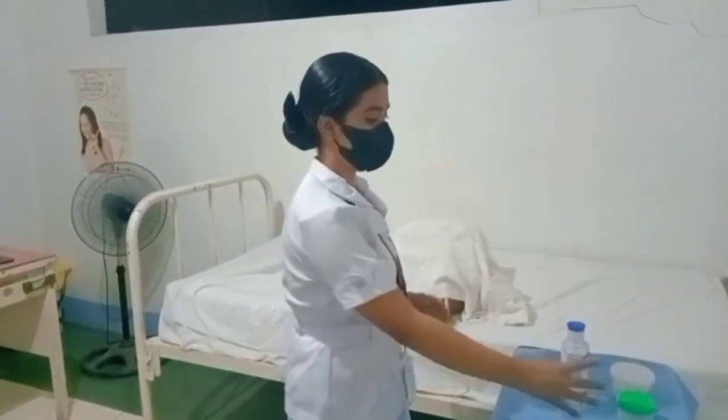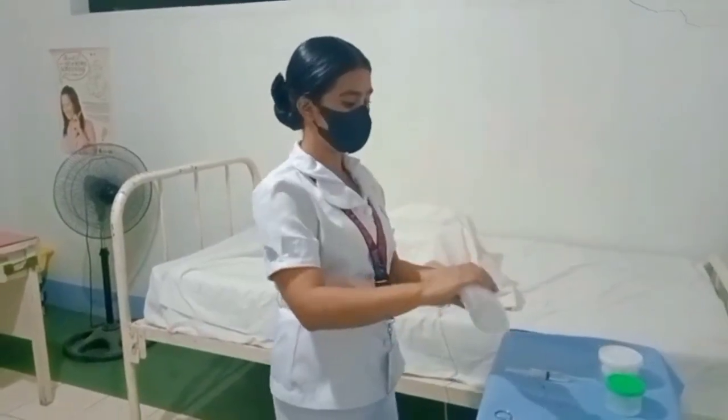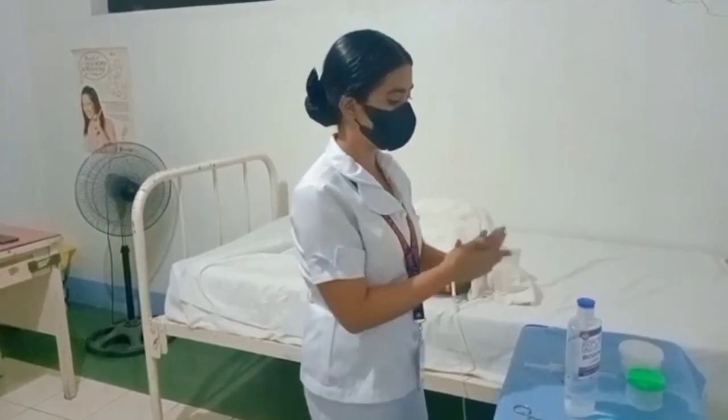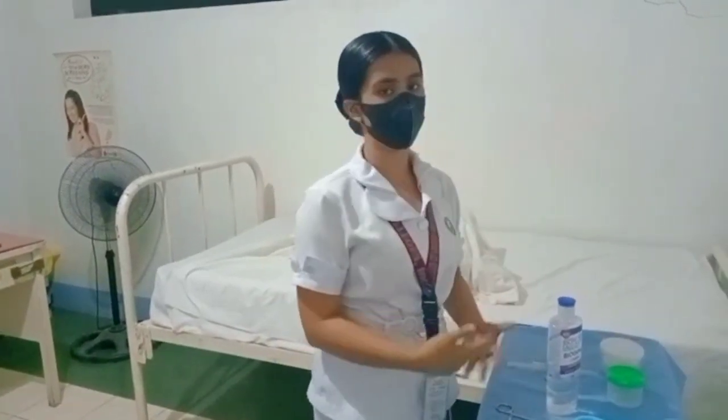For today's video, I am going to assess the removal of the indwelling catheter. Next, I am going to wash my hands to prevent the contamination of the microorganisms. And then I am going to assemble all the equipment needed.